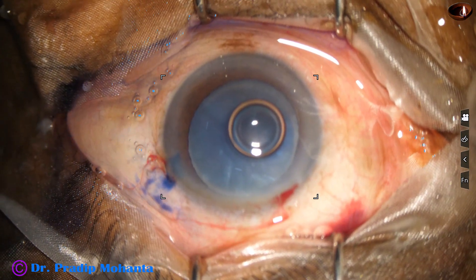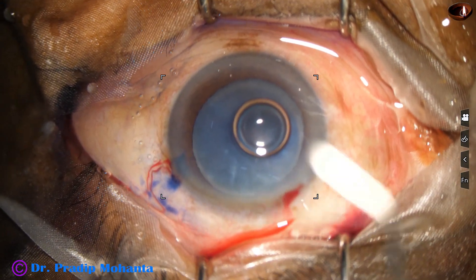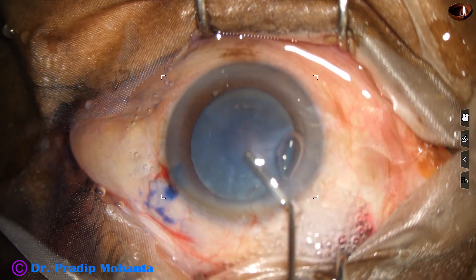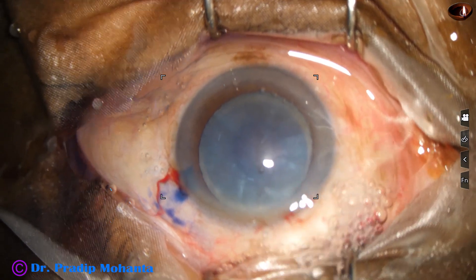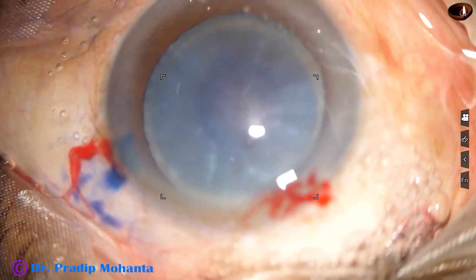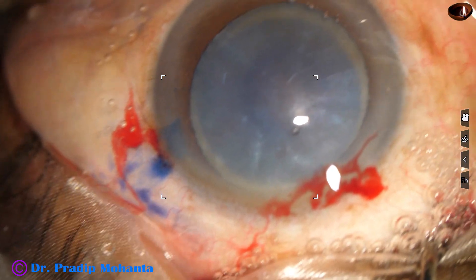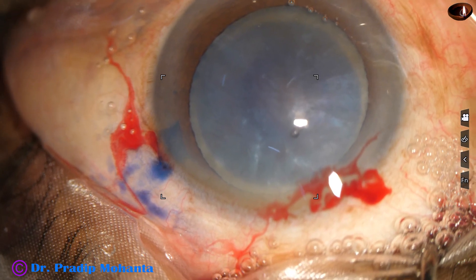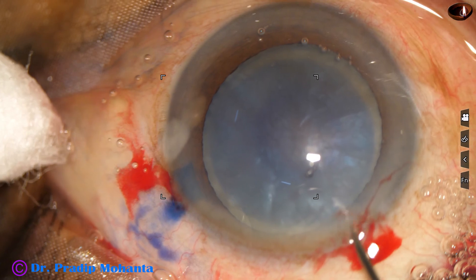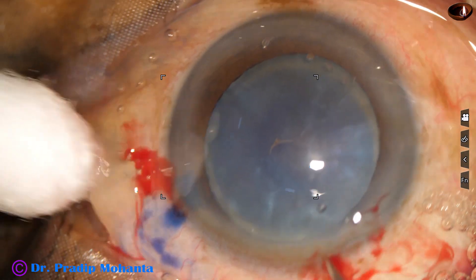Now the anterior chamber is filled up with viscoelastic substance — 2% hydroxypropyl methyl cellulose. Now is the time to do capsulorhexis. In this case, I am using a cystiotome to raise a capsular tag. The cystiotome has been made from a 26-gauge disposable needle.